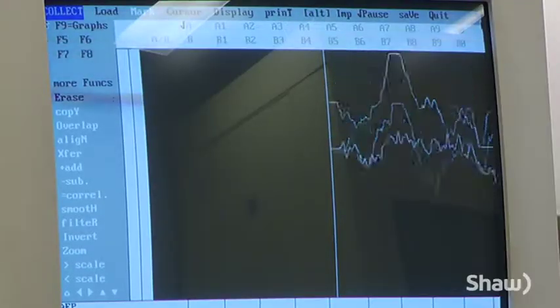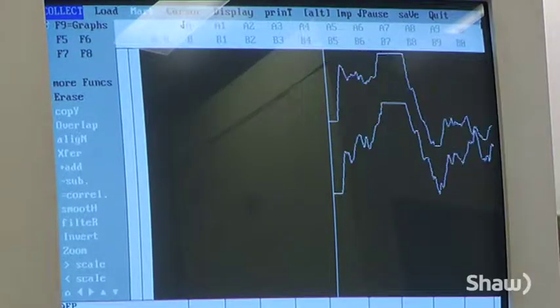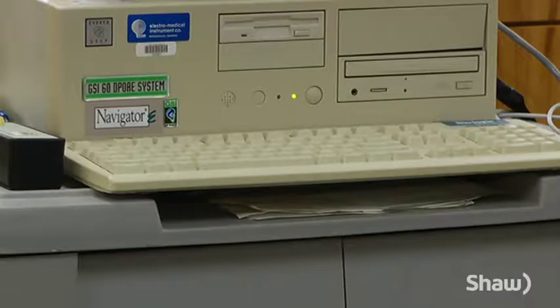Currently, the hospital does have one of these machines, but it was purchased sometime back in the mid-90s and is now starting to show its age. We have to be careful where we do the testing because it gets a lot of electrical interference with the new lights and things that are around now and all the electrical stuff that's in a hospital setting. And the newer equipment is shielded from that kind of problem.